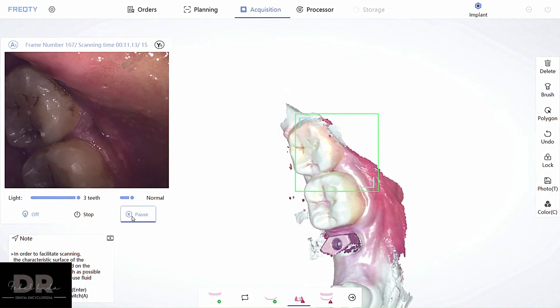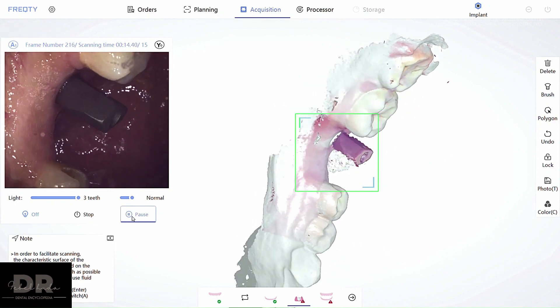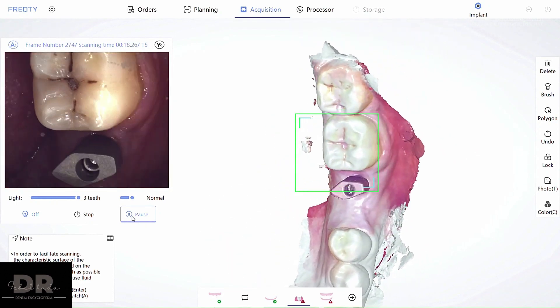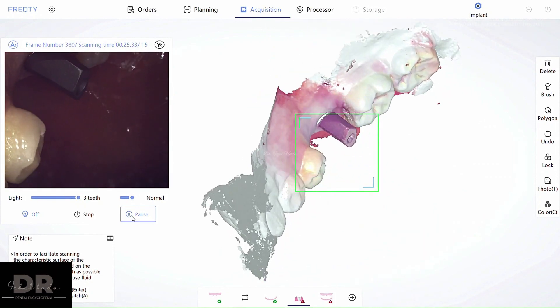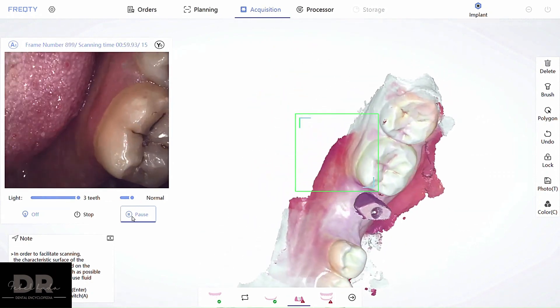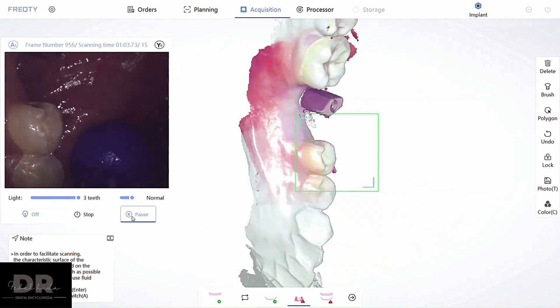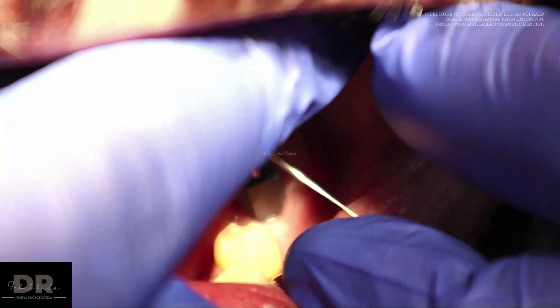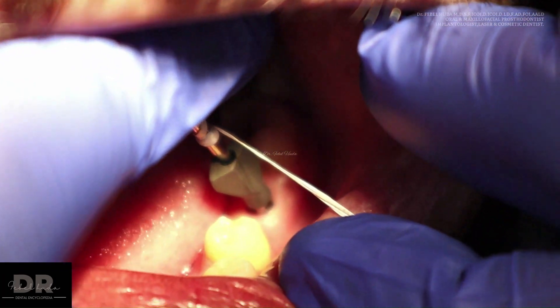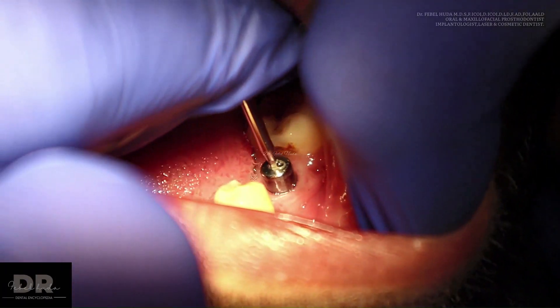When scanning with the scan body, you can see the gray image that was previously captured starting to turn color — this is the previous image merging with the image being captured right now. The soft tissue contour recorded earlier and the new scan body image start to merge and become one single image.